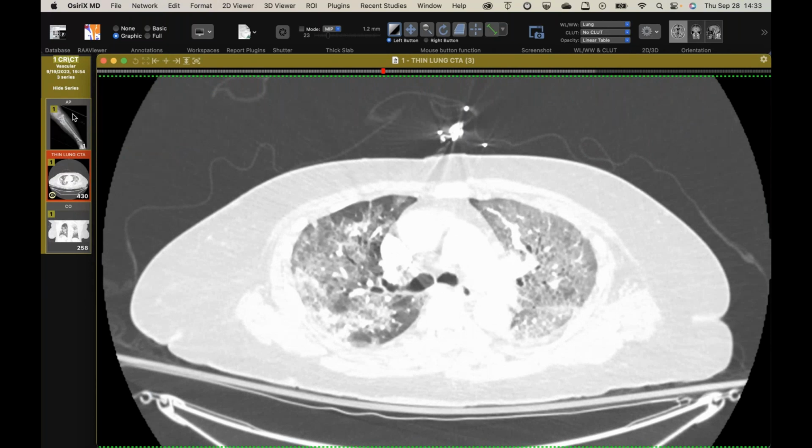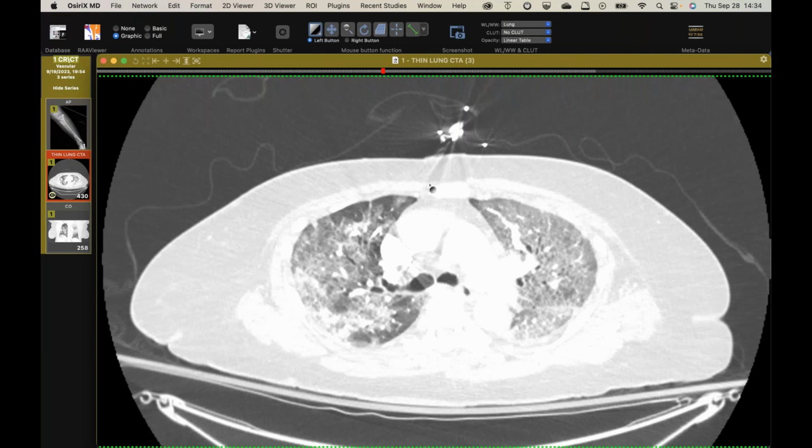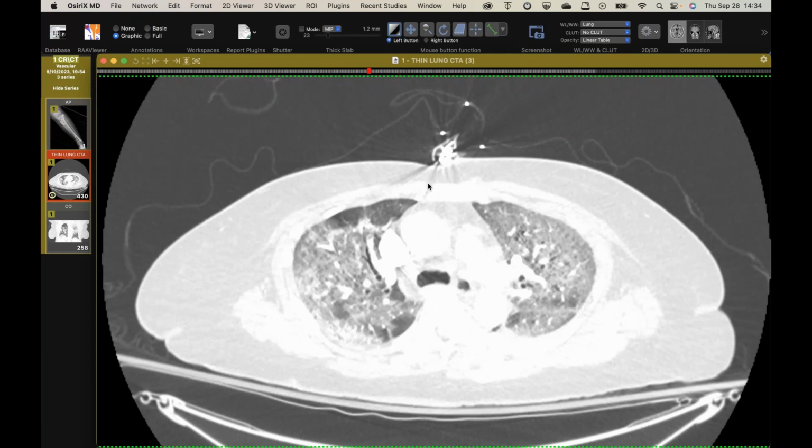And he saw this radiograph. So this lady had been sent here for a complex repair of this. You can see this tibia and fibula. The tibia in particular doesn't look quite good. So he had suggested fat embolism syndrome, which of course is a really clinical diagnosis. And usually they have altered mental status. And sure enough, shortly after this CT, she presented with some altered mental status because they did a bunch of neuro workup. So the working clinical diagnosis is a fat embolism syndrome.